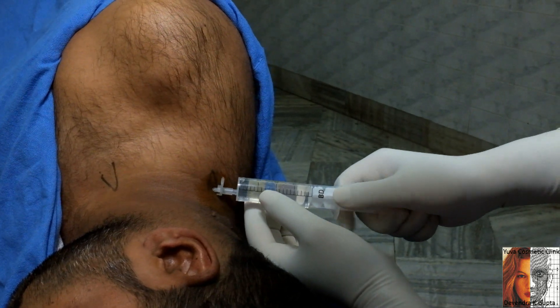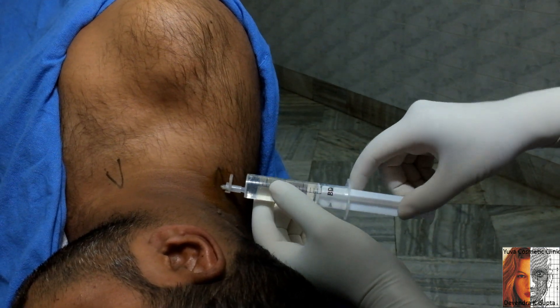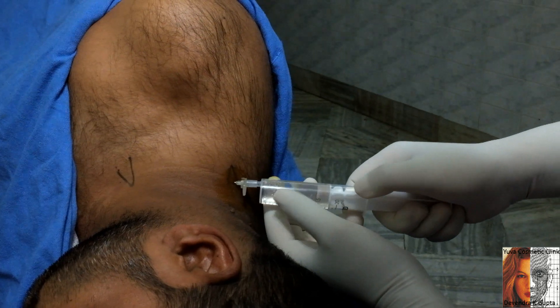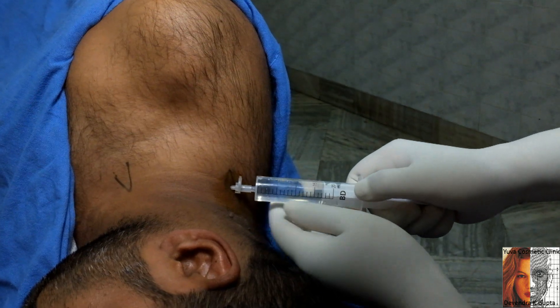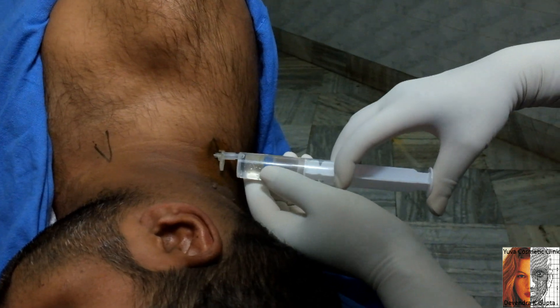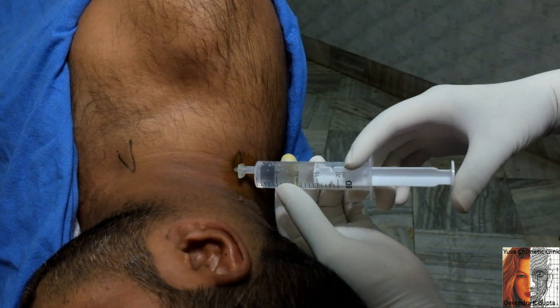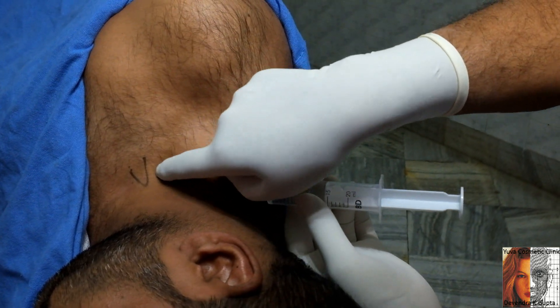I am feeling resistance, so I withdraw the syringe a bit and draw it further back. Now it is a little more controlled. There is free flow and no blood now. I can feel the needle is in the correct position.